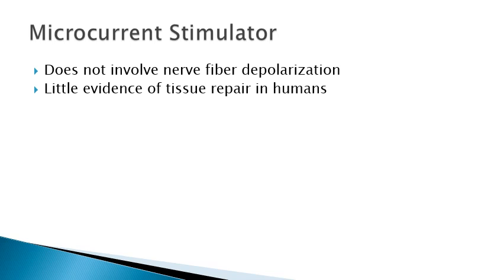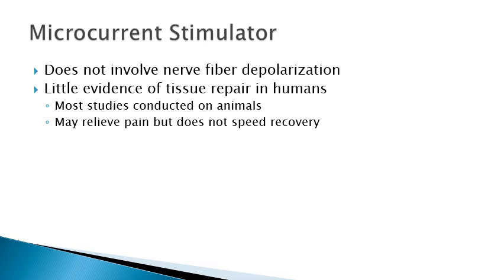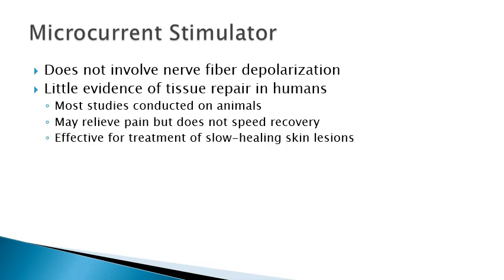There's little evidence of this. Very commonly people have tried to use this to help heal tissues, but there's little evidence of repair in humans. They do think that it could possibly help in pain relief, but obviously the pain relief mechanism is much different because you're not getting nerve fiber depolarization. It has been found to be effective for slow healing skin wounds.